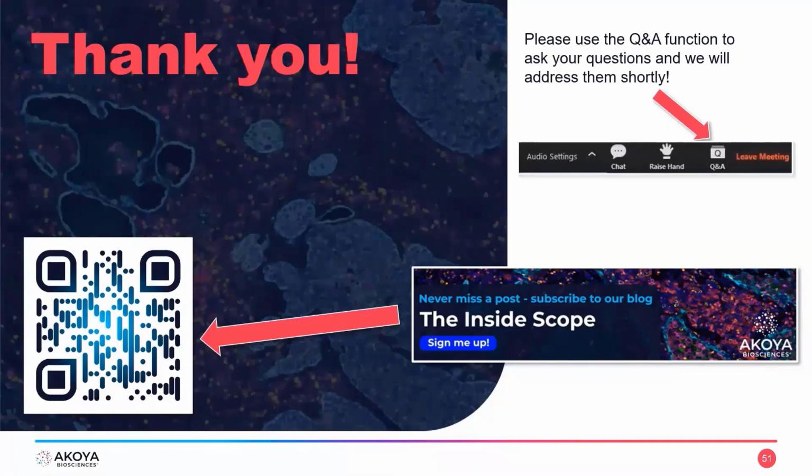How does the Polaris know how to distinguish autofluorescence from true signal? That's a great question. That has a lot to do with how our software does unmixing. The short answer is basically that the autofluorescence spectrum is distinct from the spectrum that you get from your fluors. The unmixing software takes these spectra as inputs to do unmixing. Since there's such a difference between the autofluorescence spectrum and the spectra from all of your fluors, that's how it's able to do unmixing.